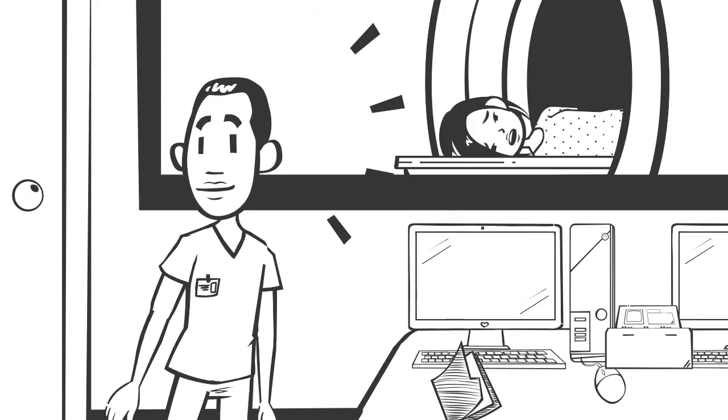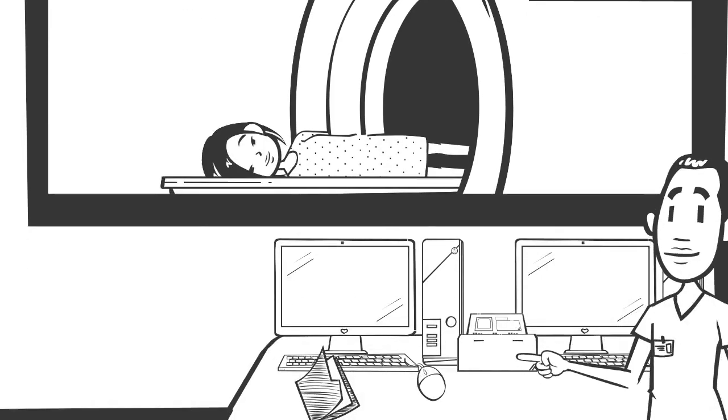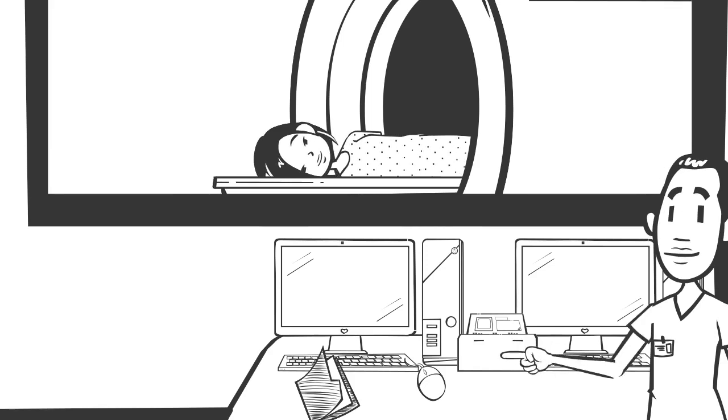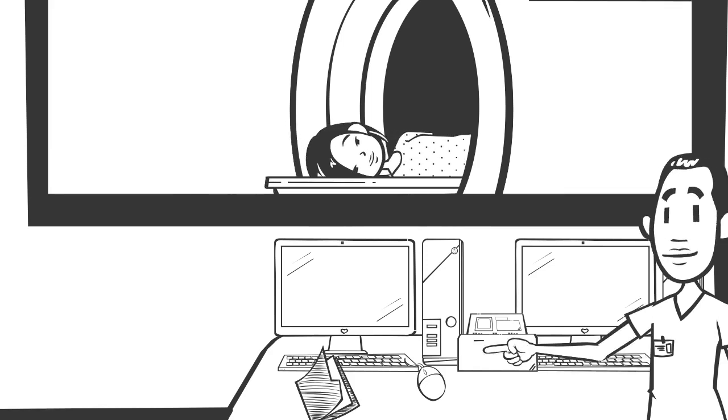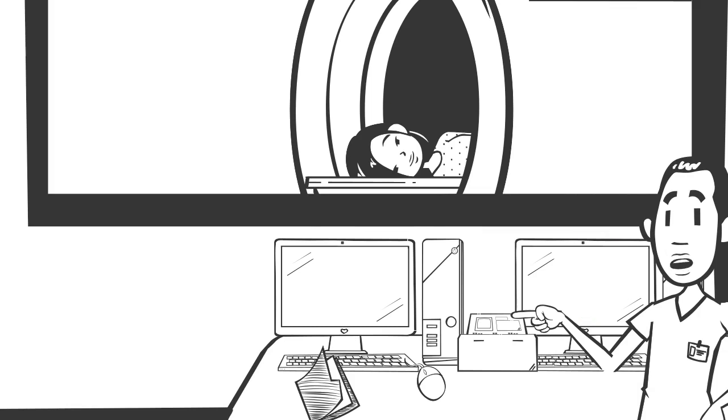You should not expect to feel anything during your scan, but if you do feel any heating or warming of the skin, please let the radiographer know as soon as possible through the intercom system so that the scan can be stopped. During the exam, the radiographer will leave the room to operate the scanner, and the bed that you are lying on might move slightly again. The radiographer will be able to hear you throughout the scan through the intercom system, and also will be able to see you. So if you have any problems during the scan, you will be able to easily get the attention of the radiographers. They will also be able to communicate with you if they need you to follow any instructions during the exam and to check whether you are all okay.